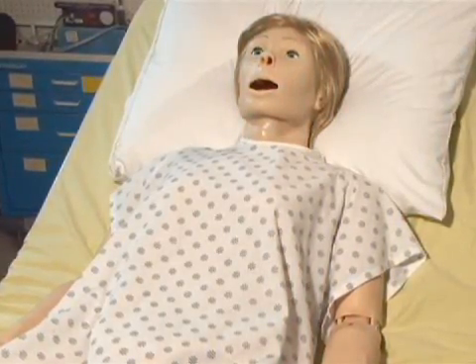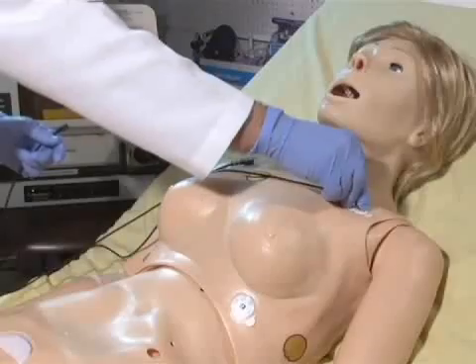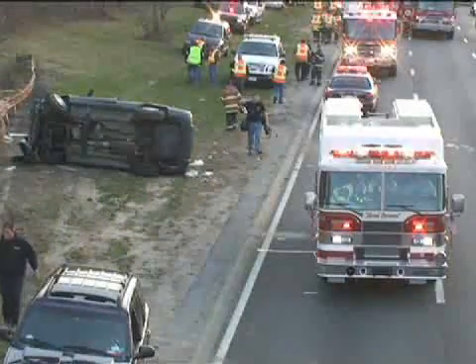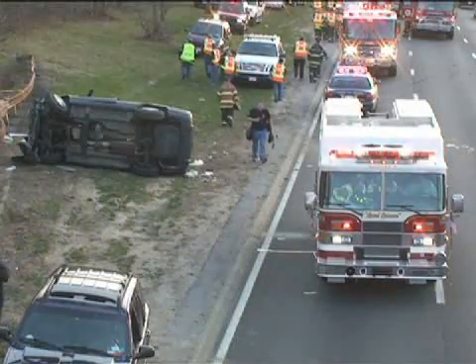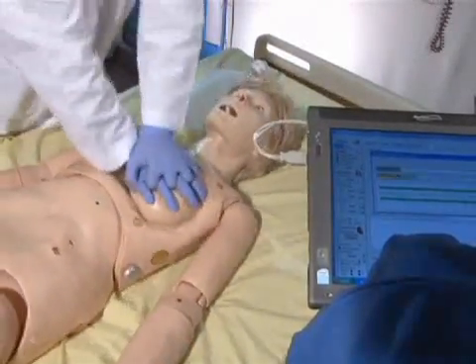GOMARD Scientific would like to introduce you to Suzy, the first advanced female simulator for both pre-hospital and nursing care. One of Suzy's many unique features is that she's tetherless and is completely responsive as she is moved from the accident scene to the ambulance and then to the emergency room. Suzy is equipped with advanced electronics that will give you comprehensive performance feedback.